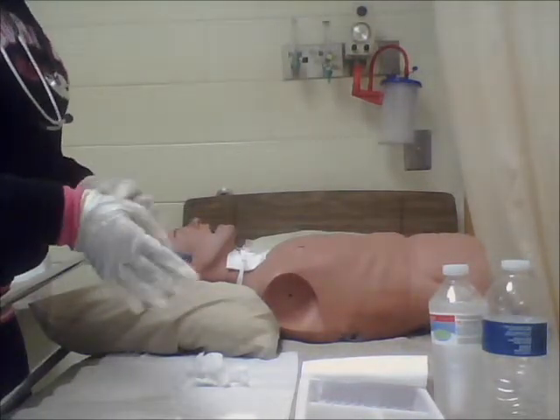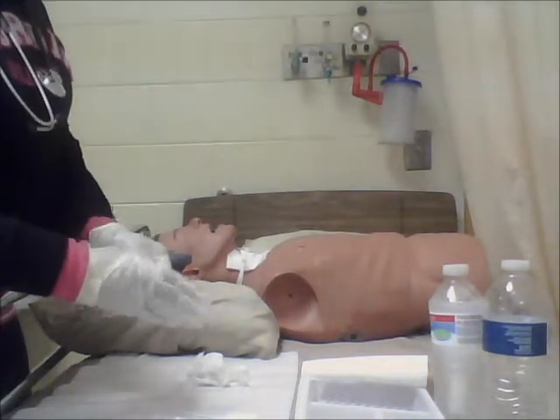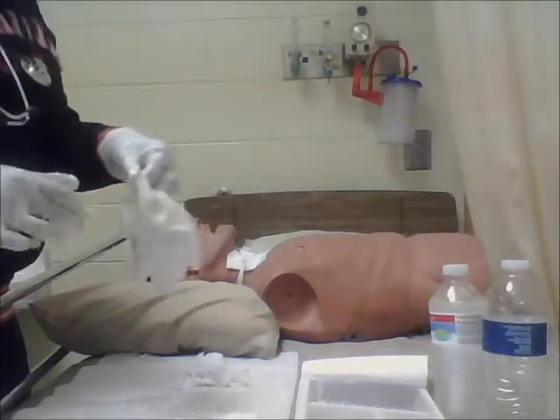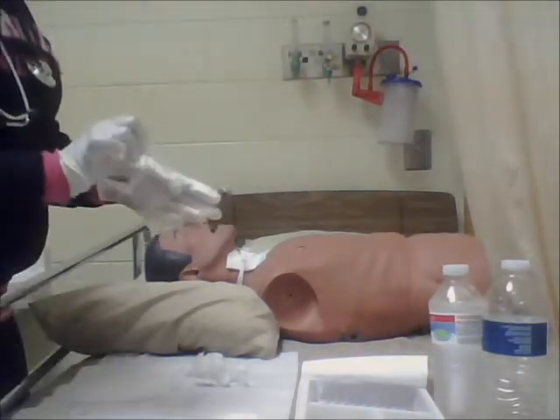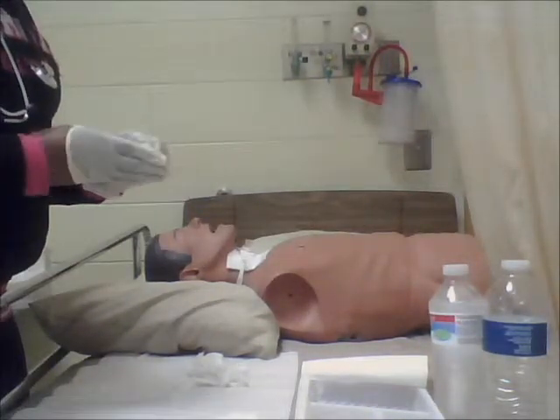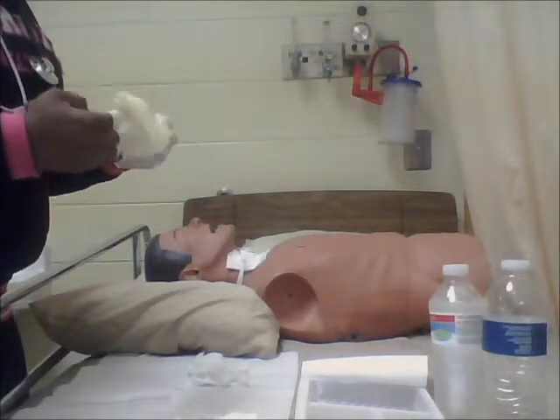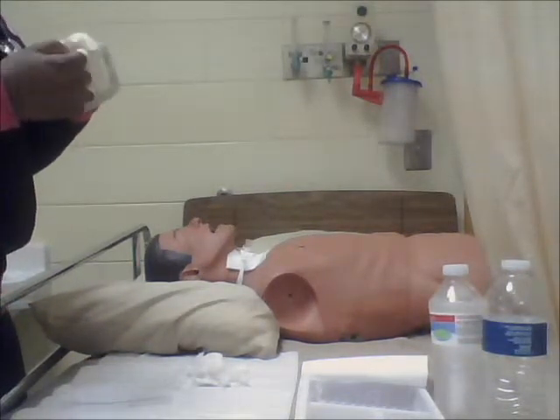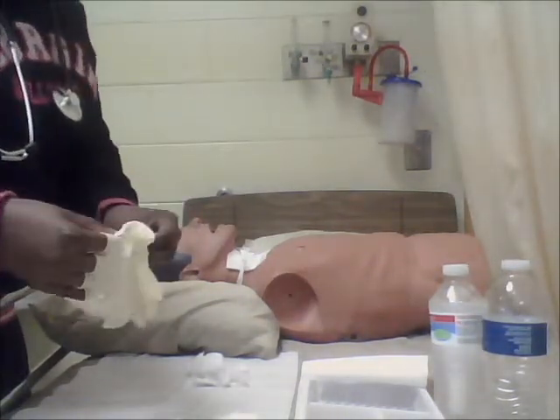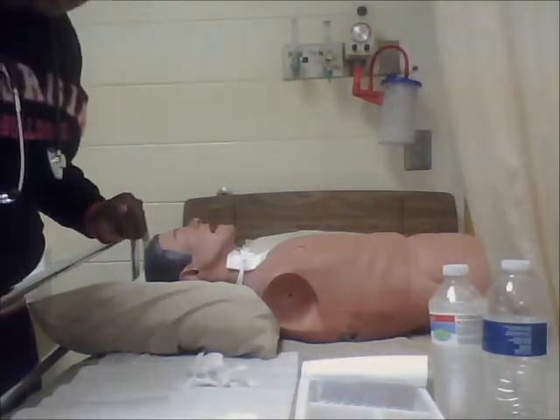So I'm going to go ahead and remove my gloves. I'll take these gloves off and wash my hands, and that's the trach care procedure.